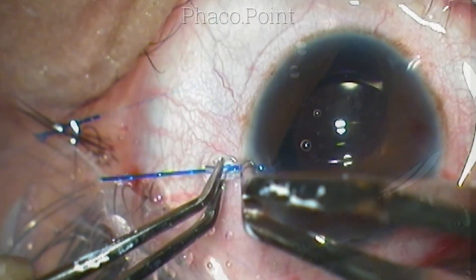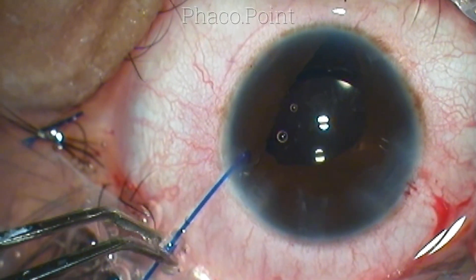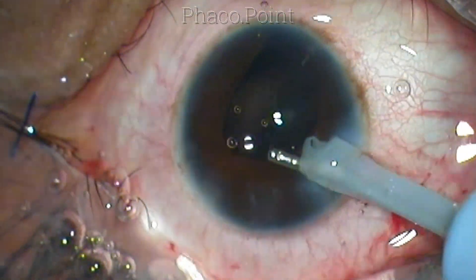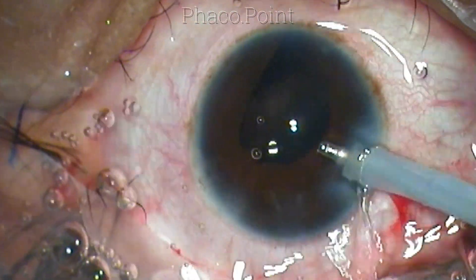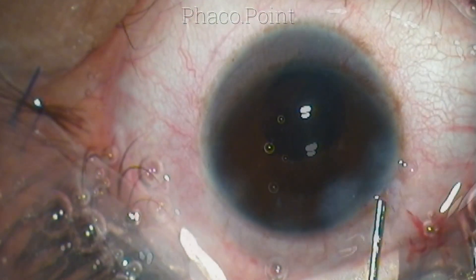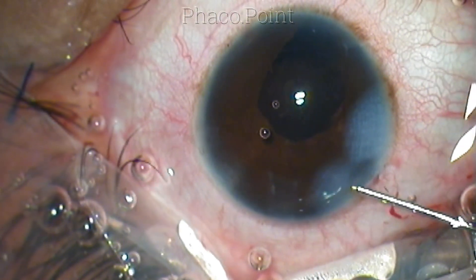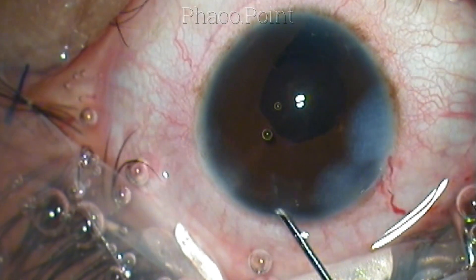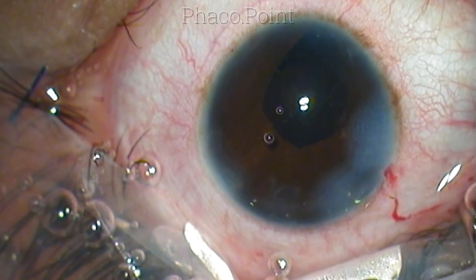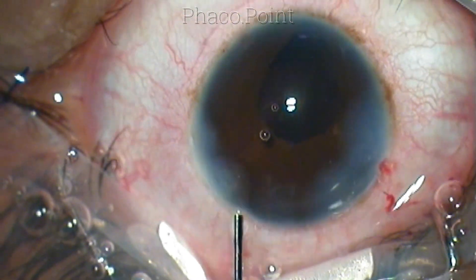The final hook was quite simple to remove because the incision was of adequate length. The key lesson: keep the incision more posterior to the limbus and about 1 to 1.5 millimeters in length — this will facilitate easy insertion, the right position, and easy removal of iris hooks. The clear corneal incision is then stromal hydrated and a little preservative-free moxifloxacin is instilled in the anterior chamber, completing the case.